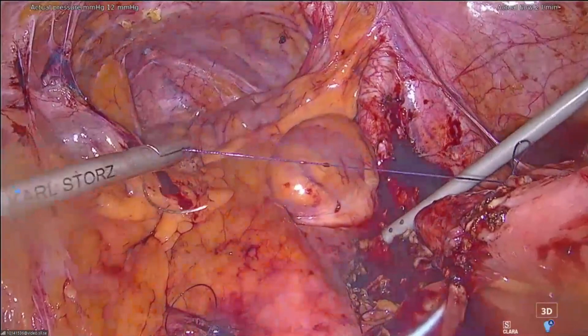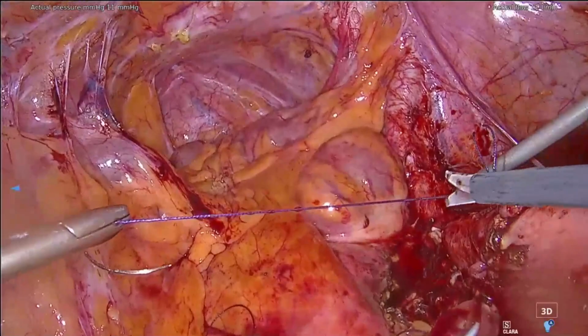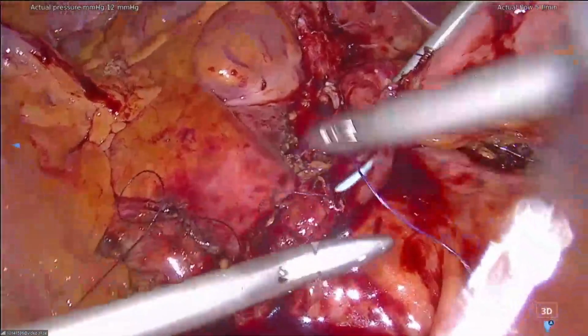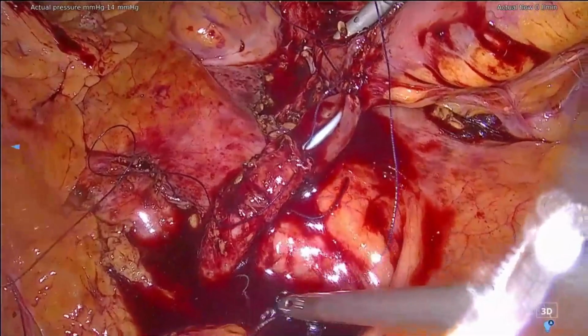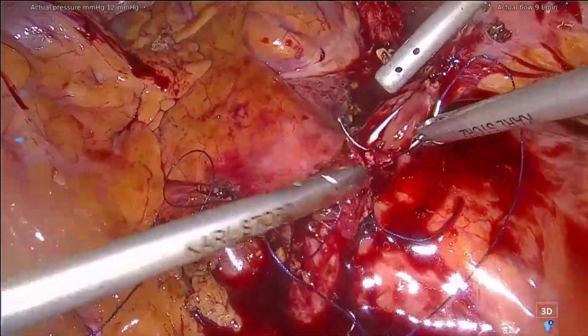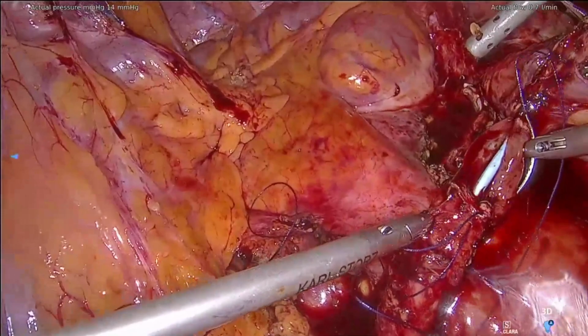And after, I just have to make the tube, the longitudinal tube, and it will be done. And we have to think about what we can do to try to extraperitonealize the Monti. Do you think it's possible also just to do an incision of the peritoneum and fix the ureter to the two margins? Yes, it can be a possibility. We have to study after what will be the best option.